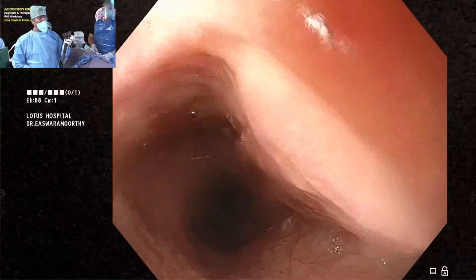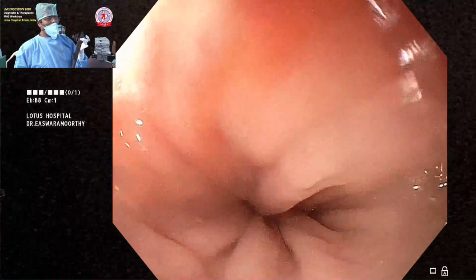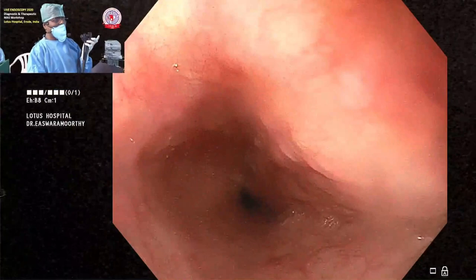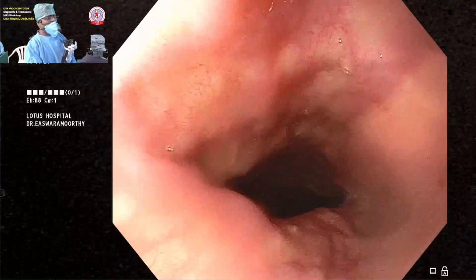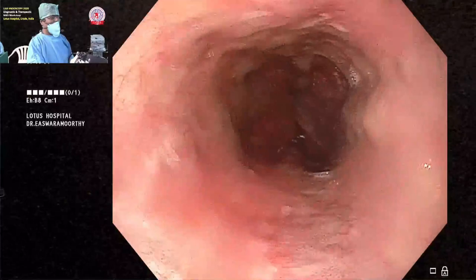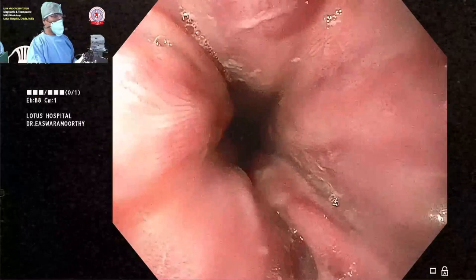The art of examination depends on controlling both the wheel and the two buttons. The superior button is suction — used mainly when there is bleeding or fluid. The inferior button is for insufflation and is used most frequently. As we advance into the esophagus, you can see small dilated veins — grade one varices. In this patient there are at least four columns of dilated veins, approaching grade two to three, with telltale signs requiring further treatment.